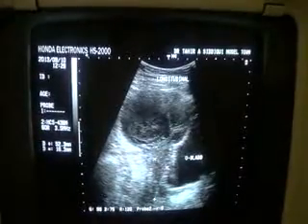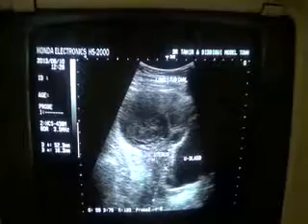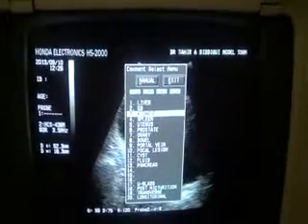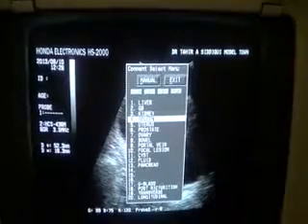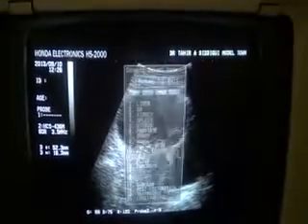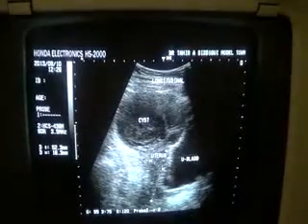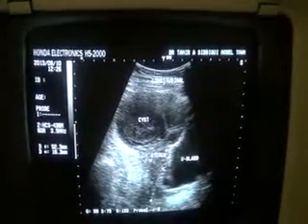She does have a history of oligomenorrhea. I am not provided with any clinical or gynecological exam or any other lab profile.